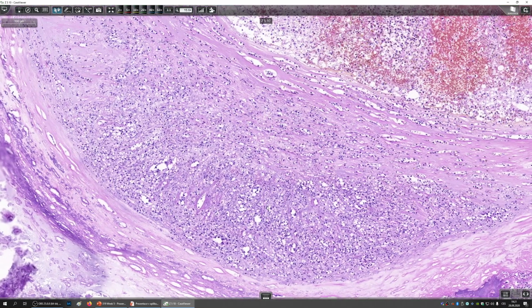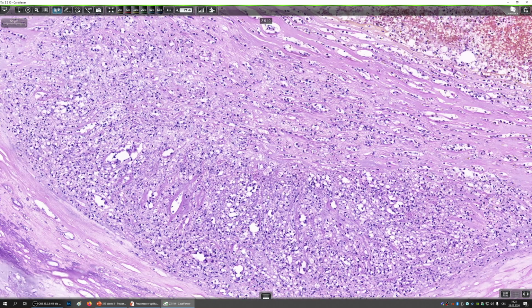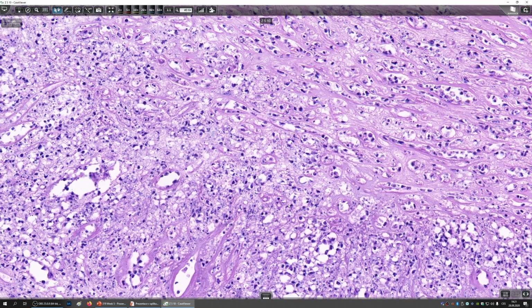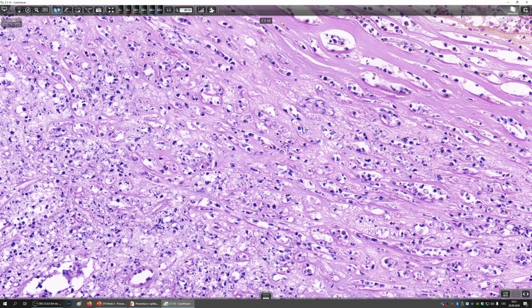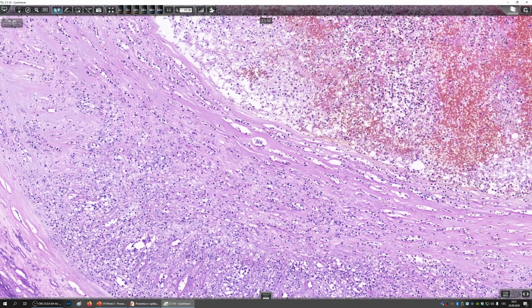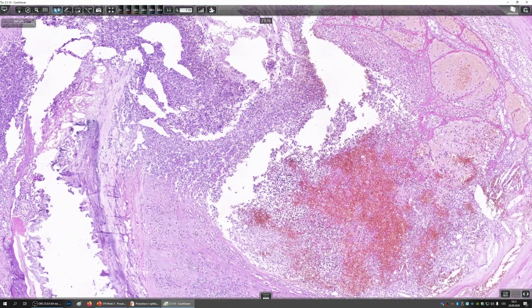One of the things that we see here is that there are blood vessels forming within it. There are a lot of foamy cells. These are foamy cells here. So it contains a lot of fat, it contains granulation tissue, and it contains a lot of newly formed blood vessels. So this is an unstable plaque. The more fat the plaque contains, the less stable it is.